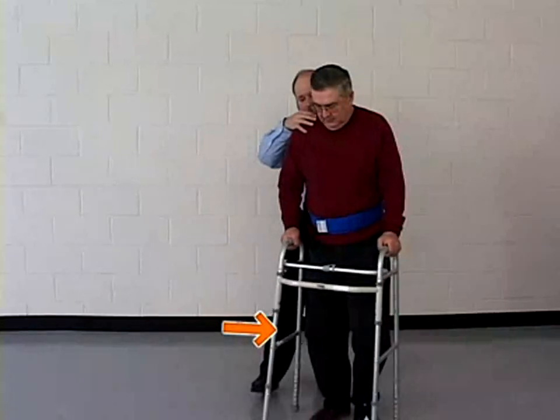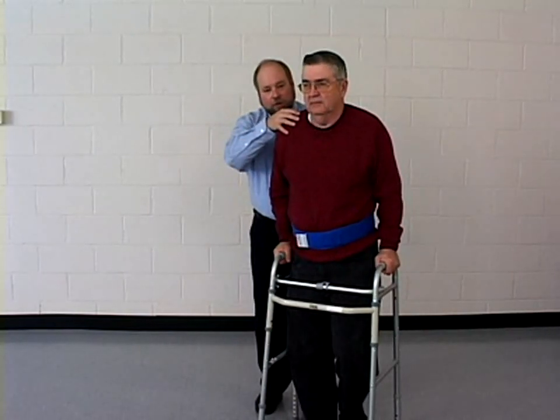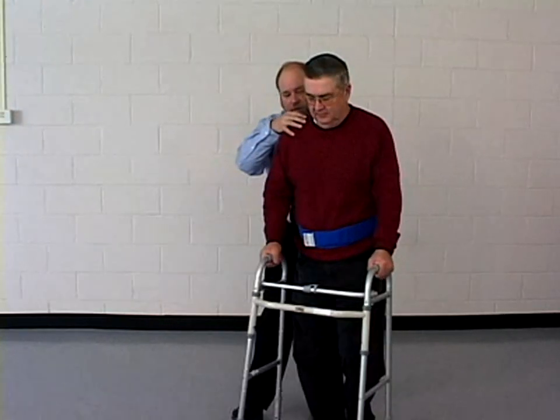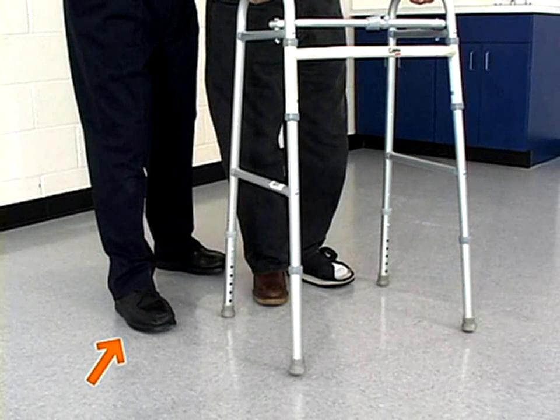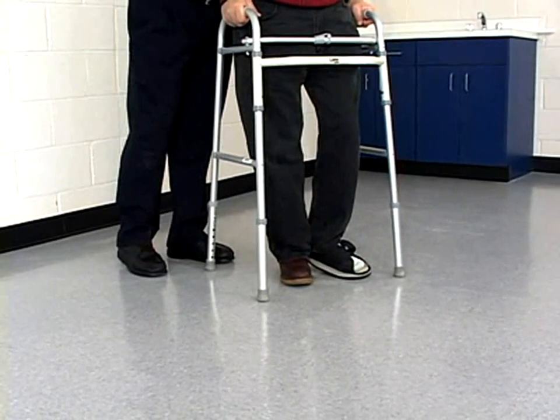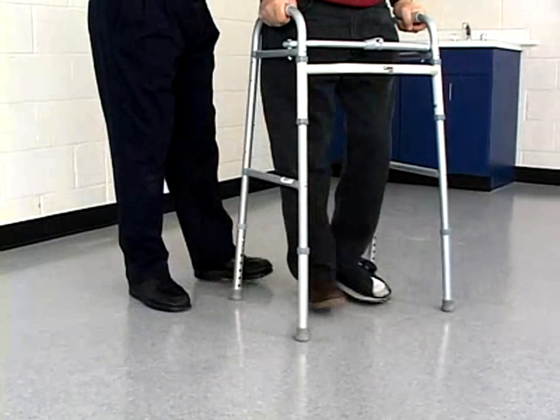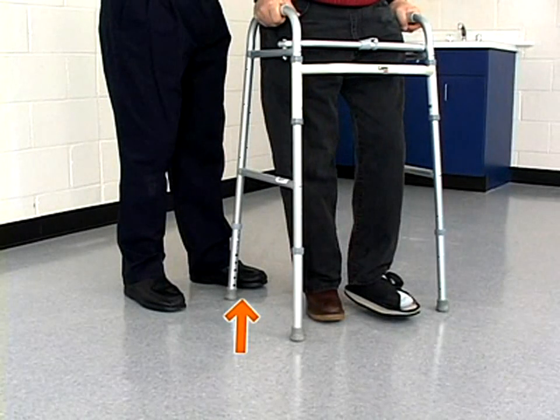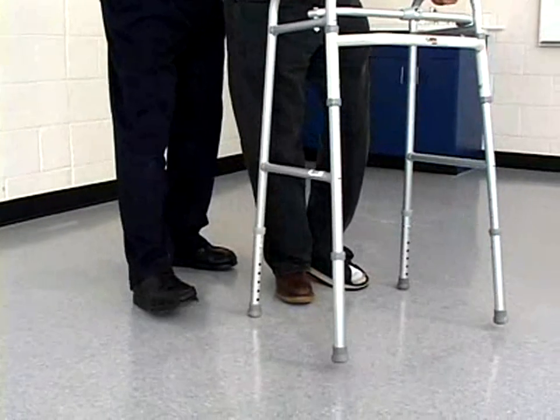The uninvolved lower extremity and both upper extremities provide support. The walker is lifted and moved forward. As the patient moves the walker, the therapist advances his outside foot. Bearing weight through his upper extremities, the patient steps into the walker with the uninvolved extremity. The therapist advances his left or inside foot to move with the patient. The total sequence is repeated for continued progression.